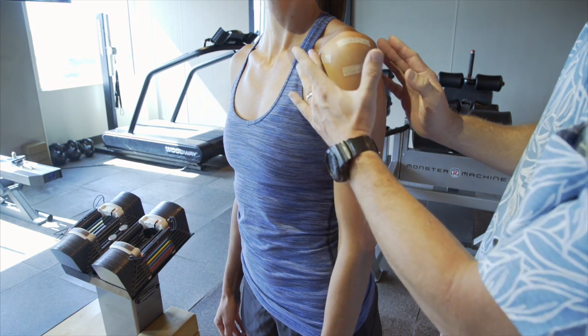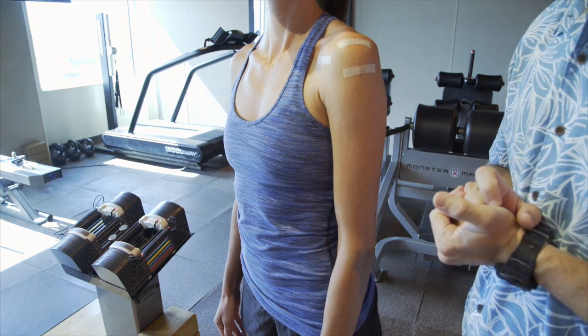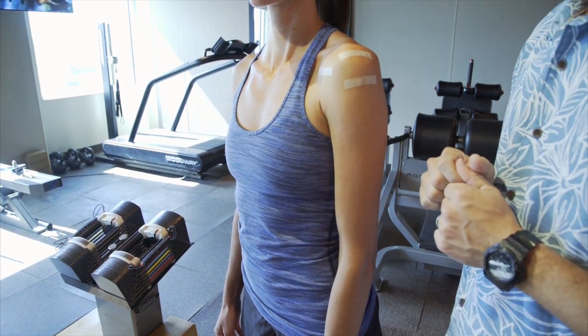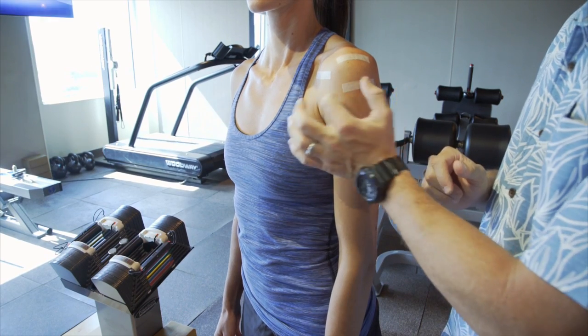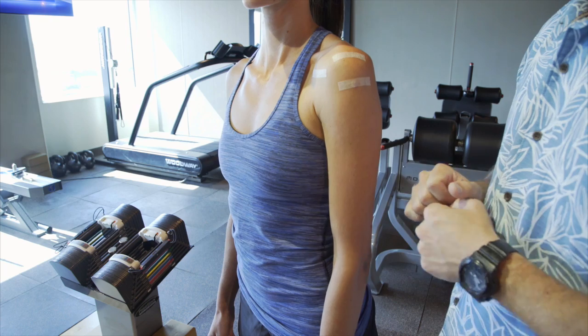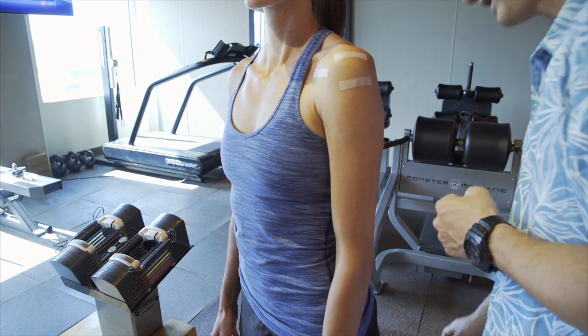After you take the dressings off, leave the Steri-strips in place. These Steri-strips can stay on for one week — you can wash over them, and you can shower with them the day after surgery. If they're still draining a little bit of blood or fluid, go ahead and cover it with some gauze and tape. For most shoulder procedures, I want you sleeping in your brace and having it on for the majority of the day.